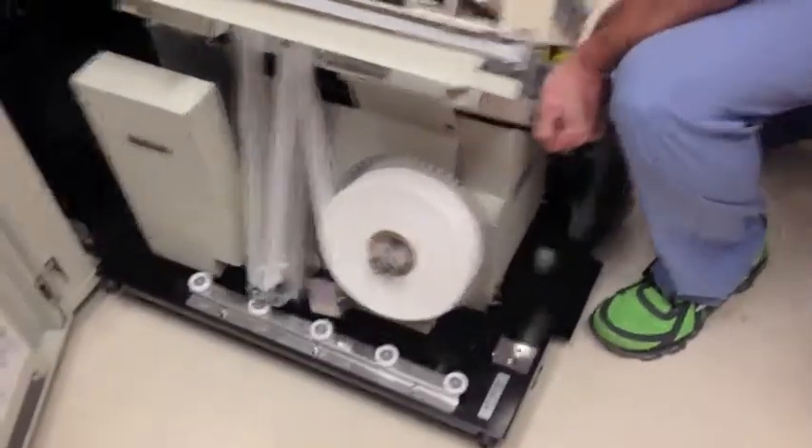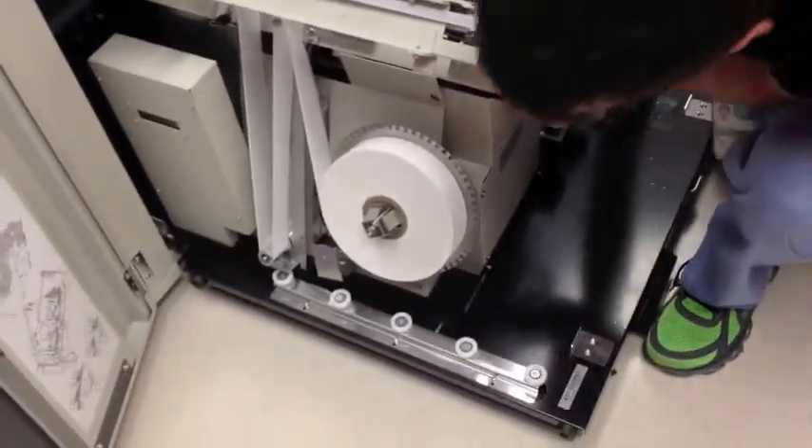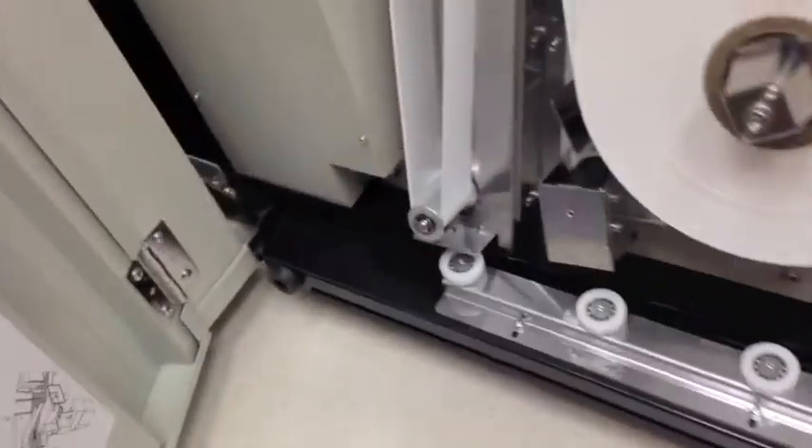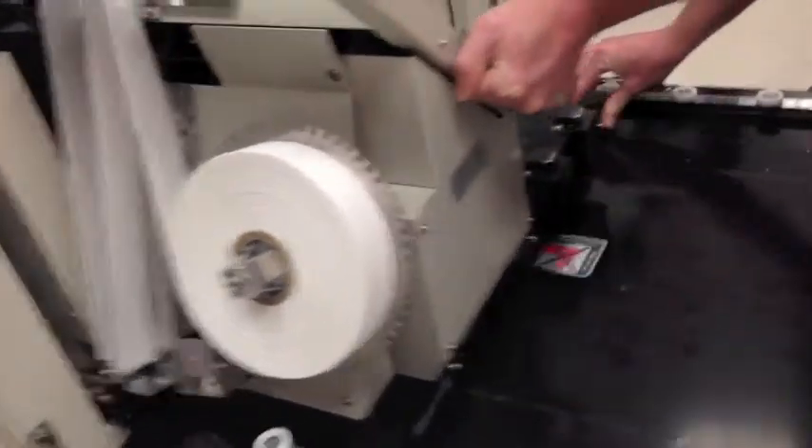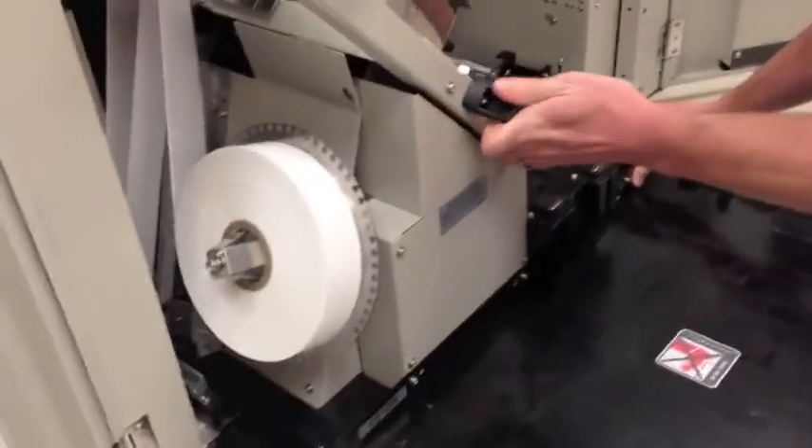Brace the trolley and push the LPU into the machine, taking care to get between the tracks on the right and left side. A little maneuvering and it slides right in.